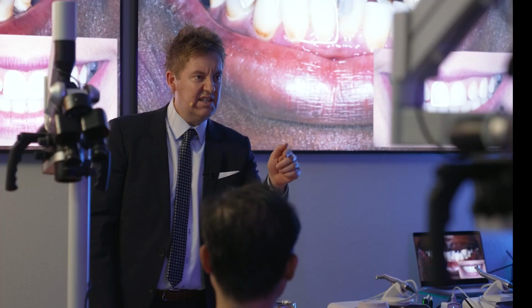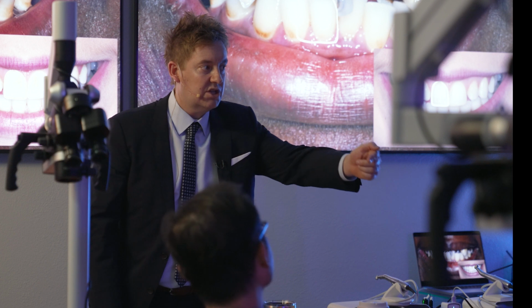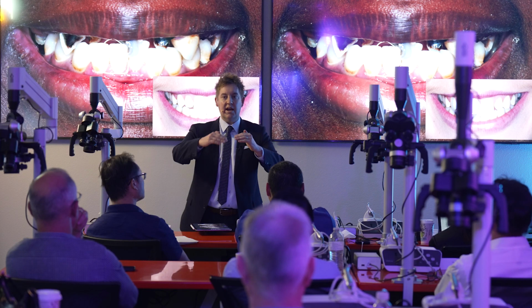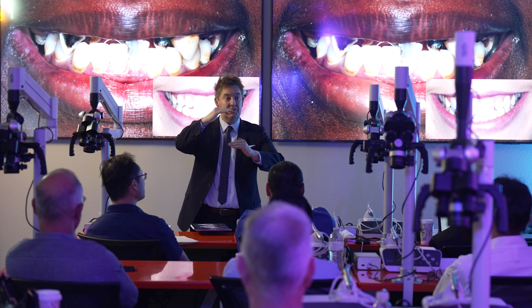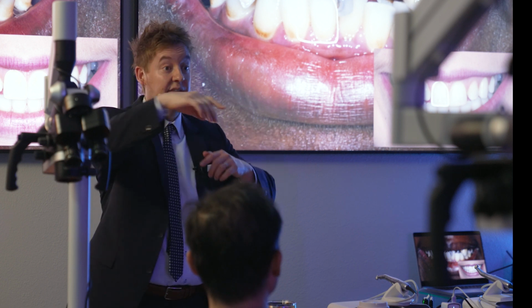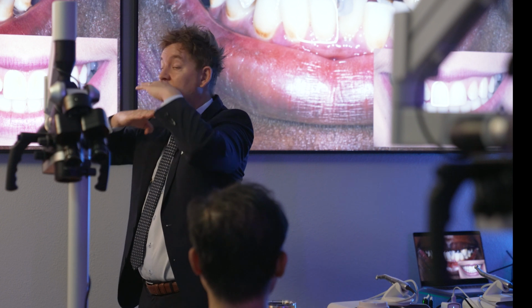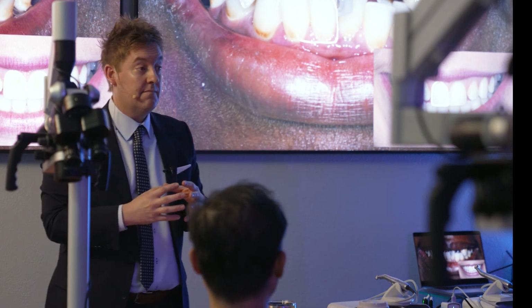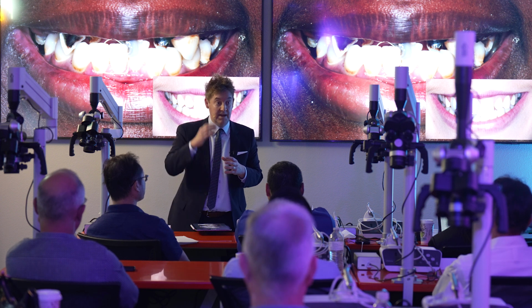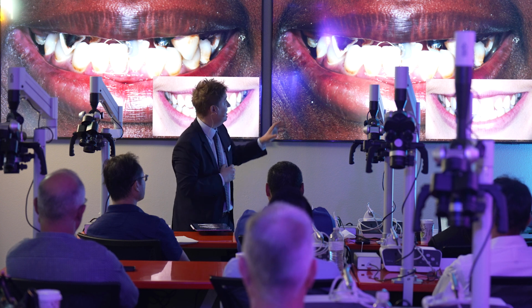So the question to all of you is, is it because she's lost vertical dimension of occlusion and she's overclosed? How would you know? You would know by looking at her face and looking at the distance between her lips. Okay, when someone is overclosed, they start to get the wrinkles, and you would look at facial thirds. So we could take a measurement from glabella to the base of the nose and from the base of the nose to the chin, and those numbers are about what? 50-50. They're 51-49, mid-face, lower face. So we could look at that and tell if they've lost vertical dimension. And I'm going to tell you, she hasn't.